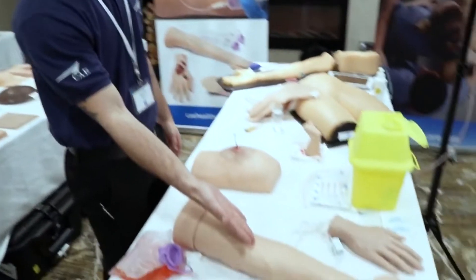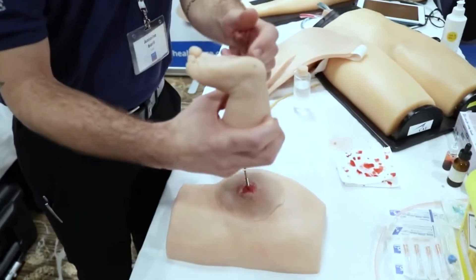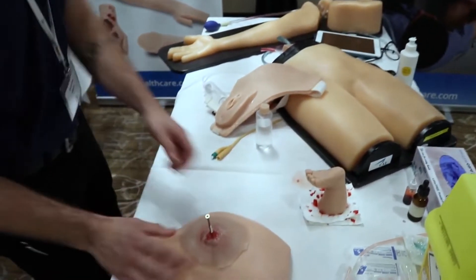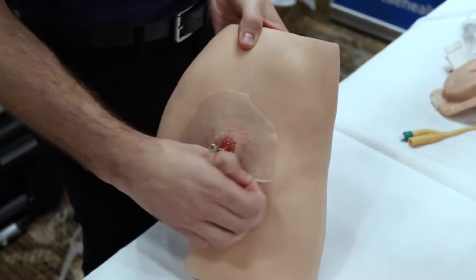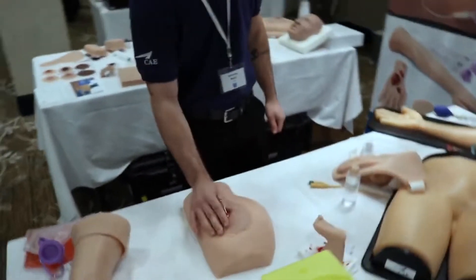We have IV arms, IV hands, a baby foot with the heel prick test that you can get a drop out of and do whatever you want with it. We have our ventrogluteal injection site with bones, and right now there's a sticky wound on it that I can just peel right off without anything left on this product.